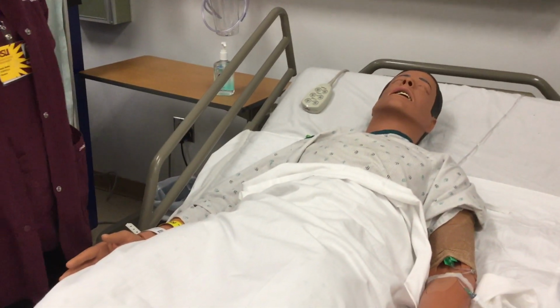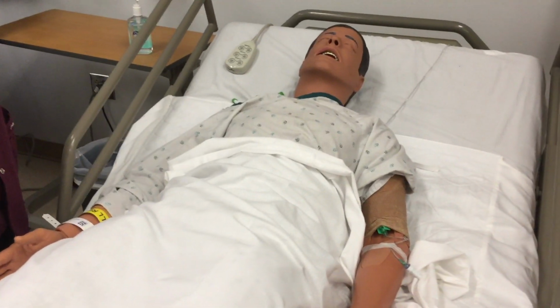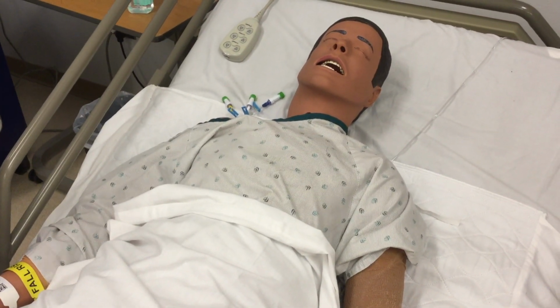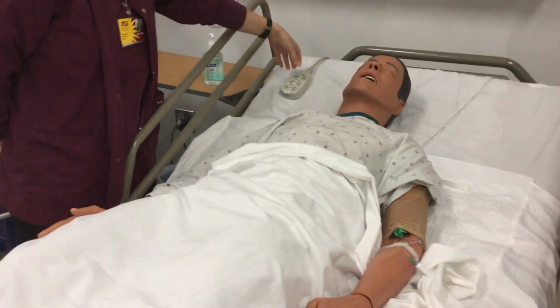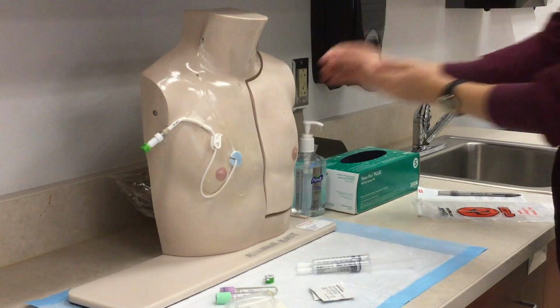Explain the purpose and procedure to the patient, answering any questions they may have. I will be performing a central line blood draw today. It involves taking blood from that line in your chest. Do you have any questions for me? Okay, no, thank you. Raise the bed to a comfortable working height. Don a clean mask, perform hand hygiene, and put on clean gloves.